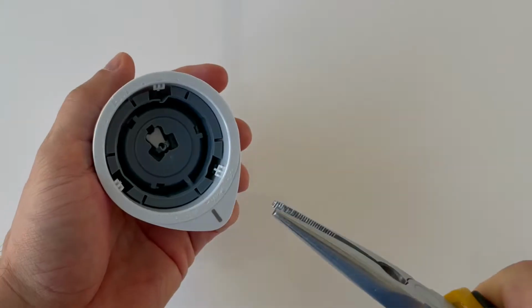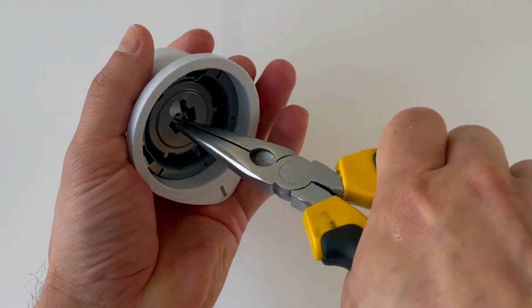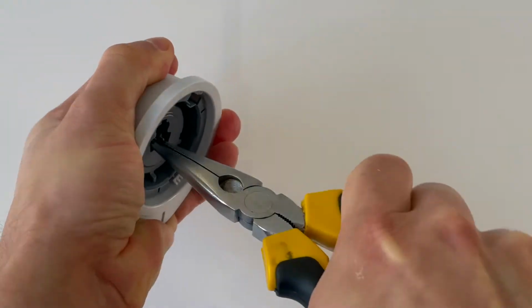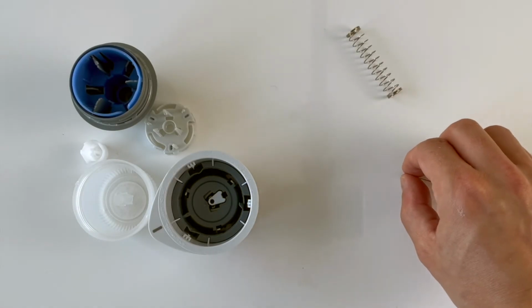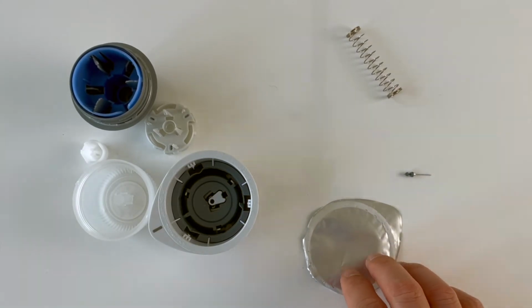The second part of the applicator is really easy to recycle because it is solely made of plastic. I tried to take the plastic parts apart, but it's almost impossible, and I think it's not really necessary because it is all plastic. So we have many plastic pieces, 1 needle and 2 metal pieces, the spring and the aluminum lid.